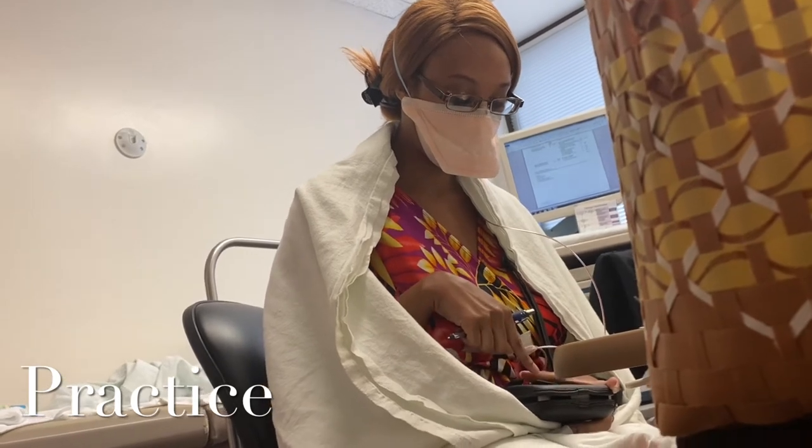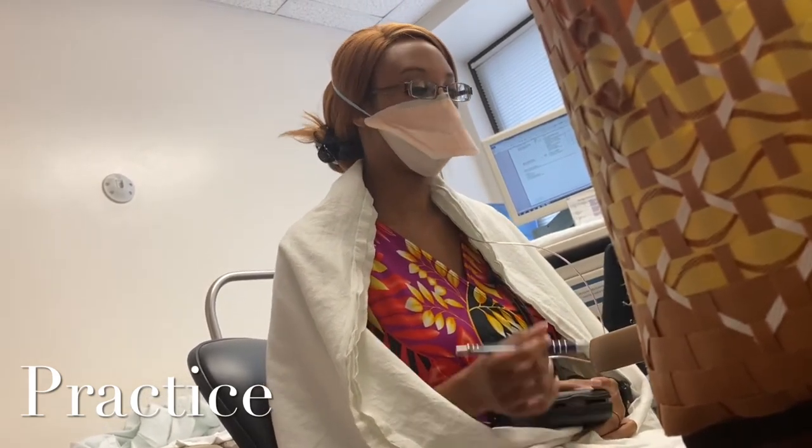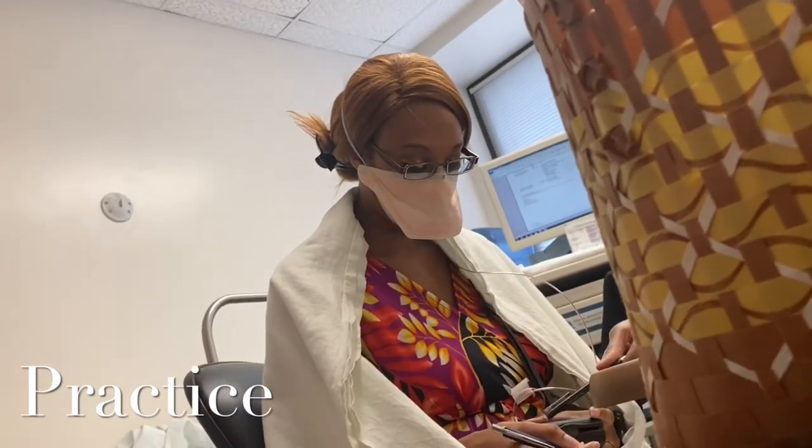And remember, if you get up and it's less than 5 minutes, you don't have to change it. Now, what are you going to do when you document your reflux medicine? How do you do that? Put the time and put a pure... And the way that you'll do it, if it's dark, you just hit the light bulb so you can see the time, okay? This one you never have to push because it's an internal diary and this works out better, okay? Any questions I can answer for you?